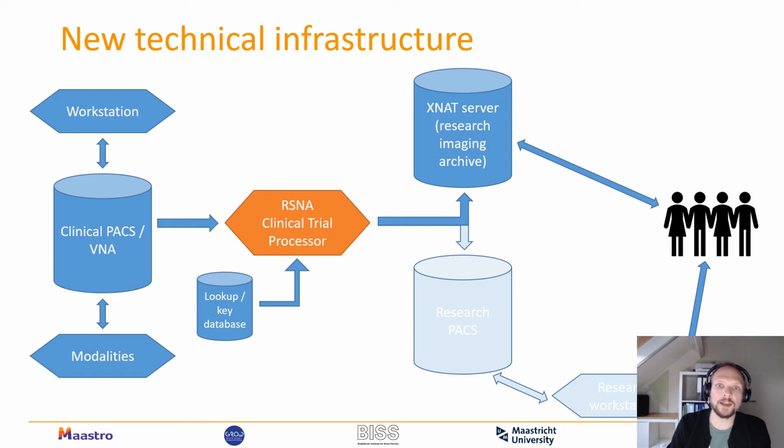However, they also get access to some part of the metadata, specifically the patient, study, series, image information, which is in the metadata of these medical images.